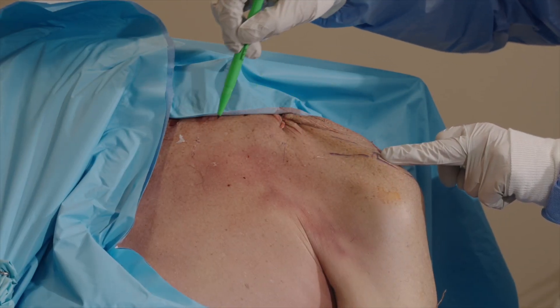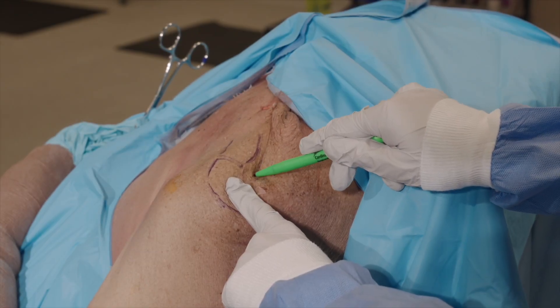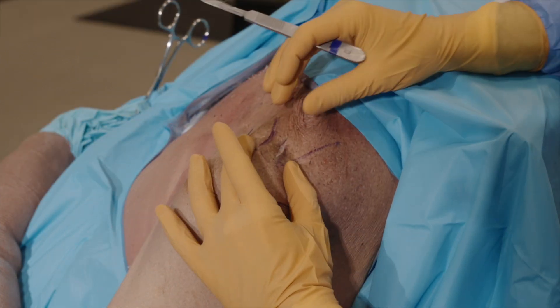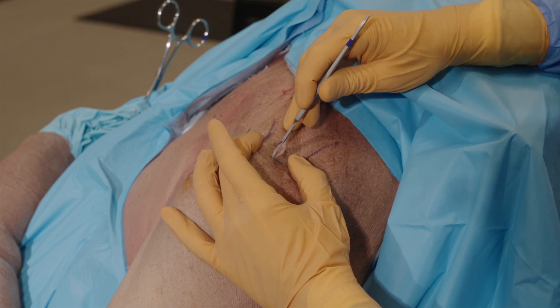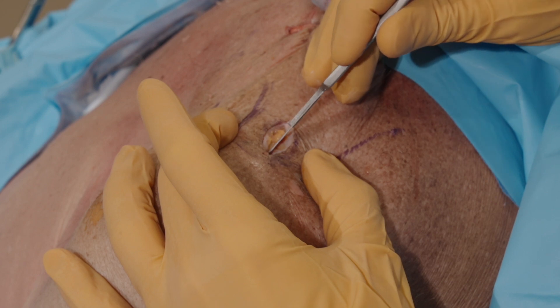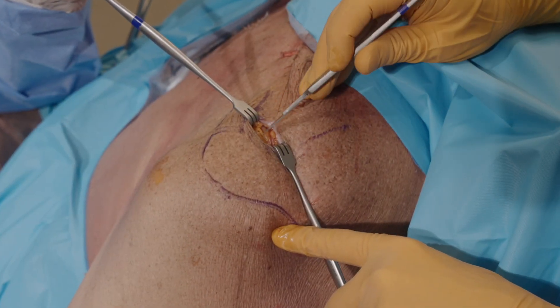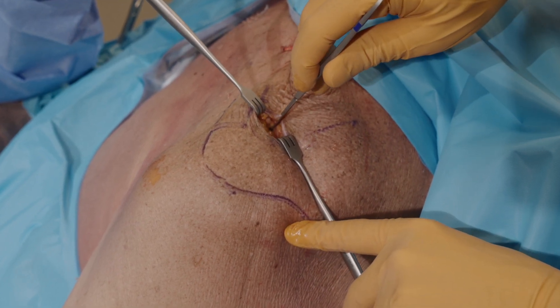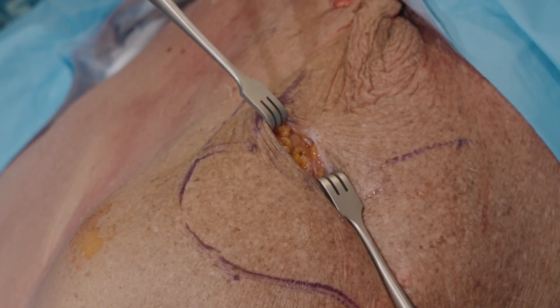The posterior conoid tubercle is often easily palpable. Mark the location of the skin incision just posterior and lateral of this. Make a two to three centimeter incision through skin and subcutaneous tissue at the previously determined location. Direct the dissection medially towards the posterior conoid tubercle. Do not open the AC joint. Identify the fascia of the trapezius muscle and proceed to peel this off anteriorly and superiorly with, for example, a key elevator so that direct access to the posterior conoid tubercle is obtained.